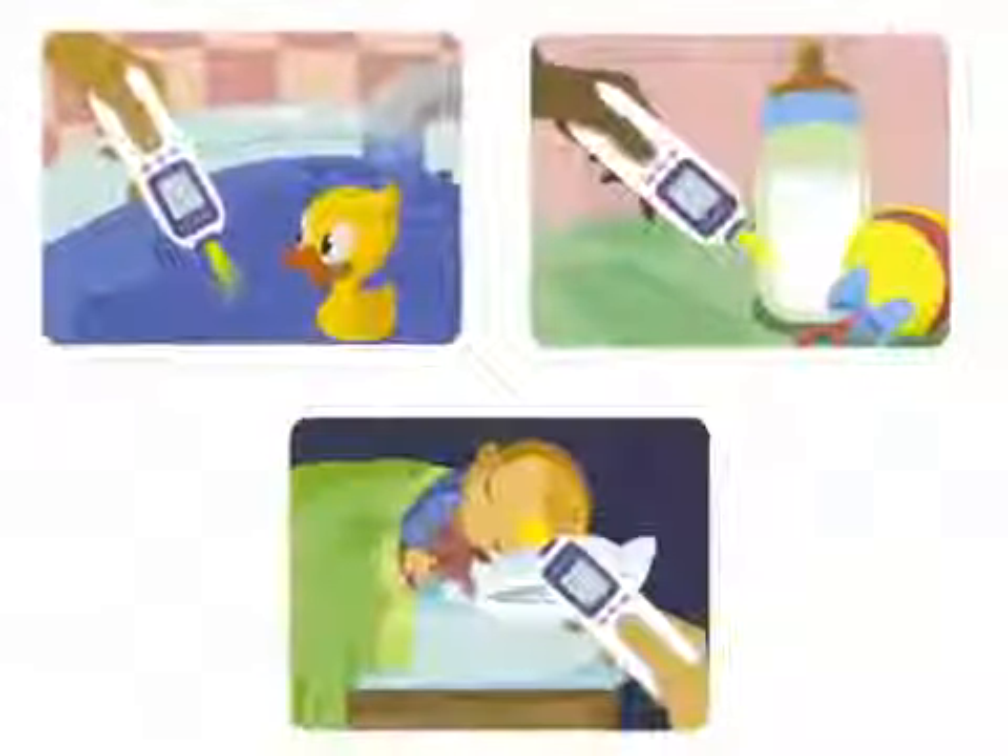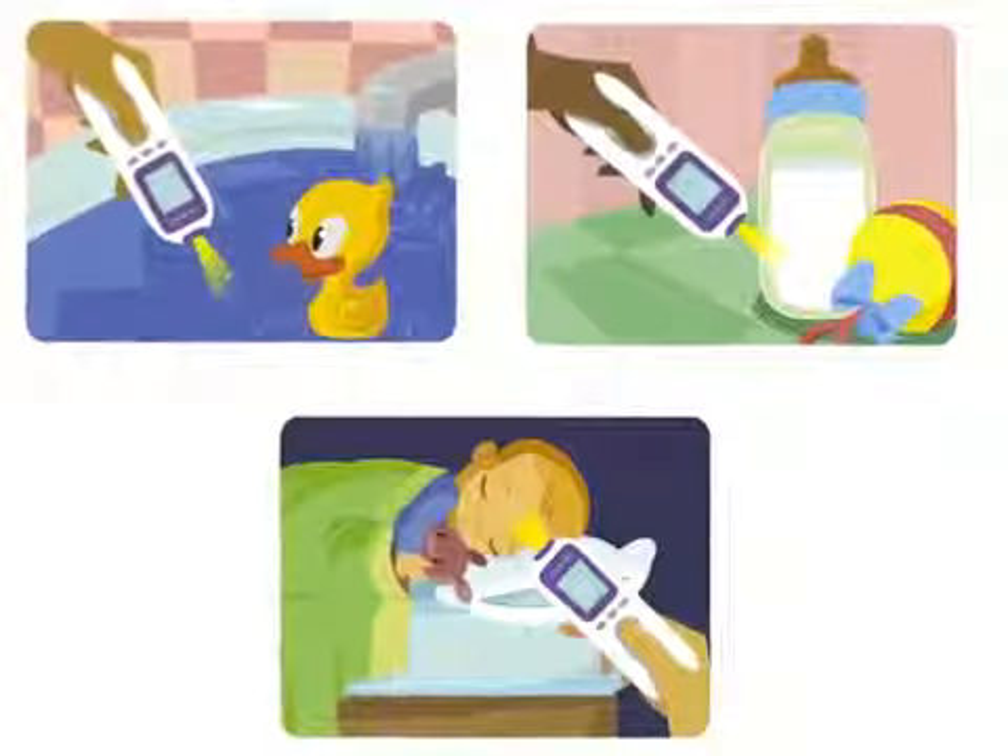The Veritemp can also be used to measure inanimate objects like baby's bathwater, bottle, food, or nursery.